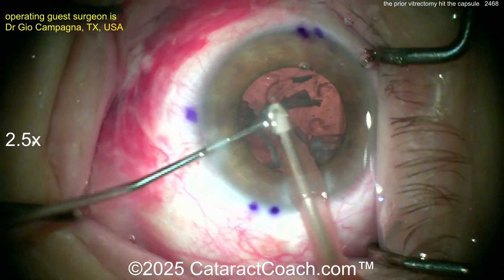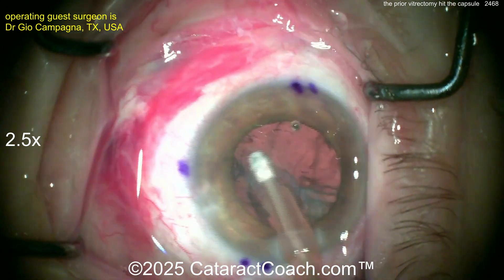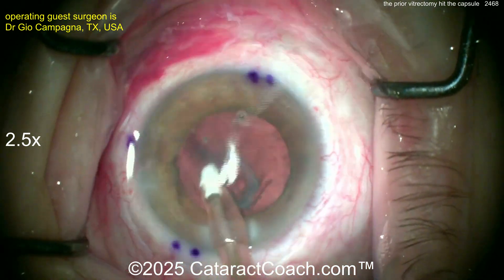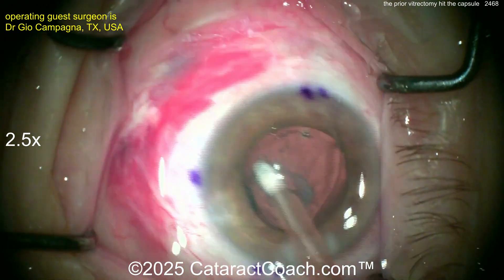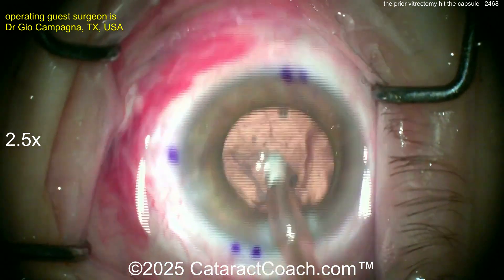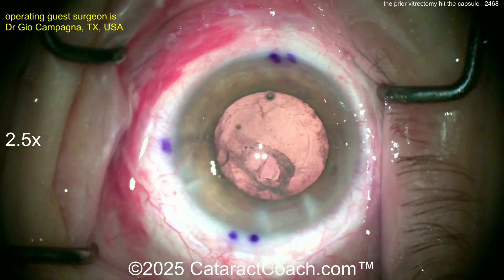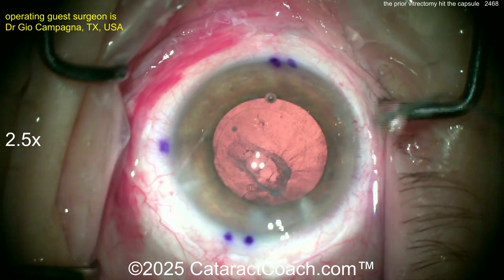Here is the cleanup of the cortex. What do you do with the bag there? The good news is there is no vitreous, so you can't get vitreous prolapse. Maybe try to take out all the cortex that's not at that scarred spot, and then address the scarred spot last. There's a lot of shaking and cleaning up. Now, what do you do with that big plaque there? Try grabbing that cortex. Can you peel that plaque off? You may want to just not, or maybe do a posterior rhexis. Not sure what's happening back there. Here's some viscoelastic — that's a good idea. Now the capsule looks like it's opened up a bit. Yeah, there's a big hole in the capsule now.